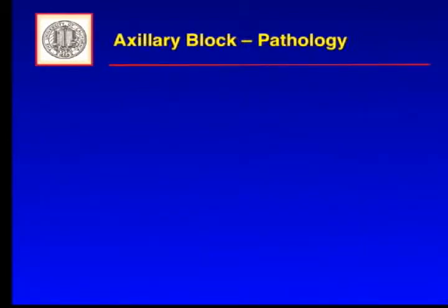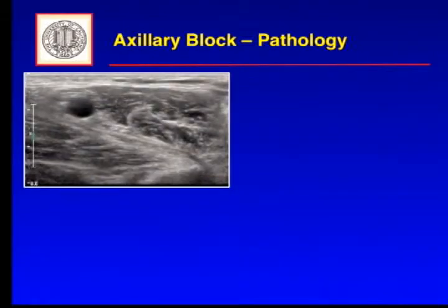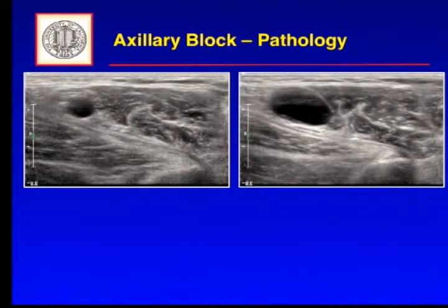Here's an axillary block I did a few months ago. We start scanning the axilla at the level of the conjoint tendon. You'll notice the axillary artery here, conjoint tendon here — that looks okay. But we like to look around, and it looks a little bit different here. We're still at the level of the conjoint tendon but now the artery looks a little bit different. It's enlarged, it's eccentric, and maybe there's something in its lumen as well.